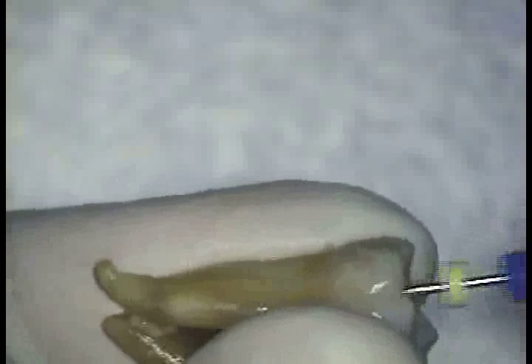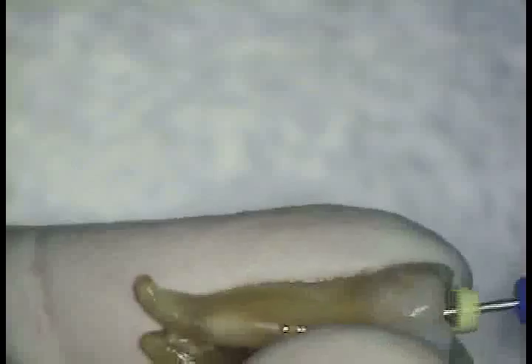We then pull back 1 mm when using the 30-relieved reamer. We again check our patency with the 25-relieved reamer, the last instrument that went beyond the apex. This is followed by the 35-relieved reamer. The 25 once again confirms patency.